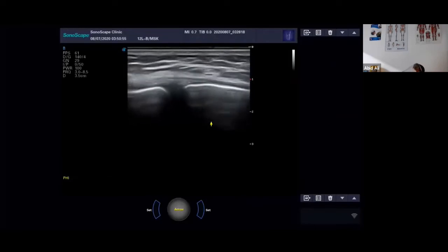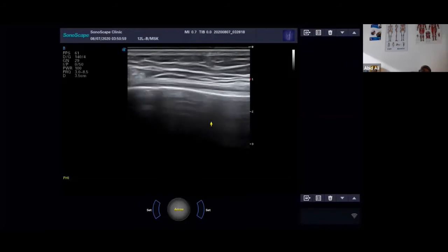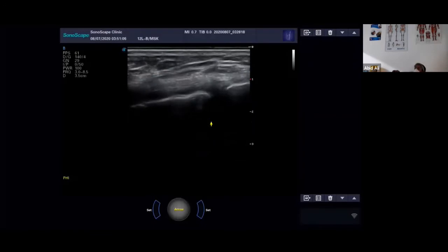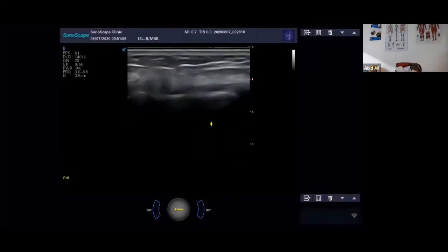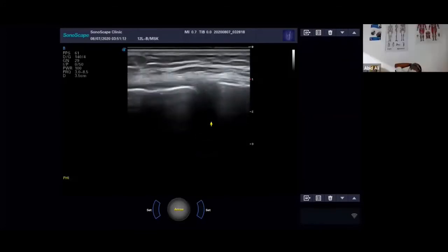So sorry, whoever asked that. That doesn't routinely come to ultrasound. Looking at those is tricky. Theoretically, I suppose, with a bit of time, a bit of a play around. Oh yeah, the right kit.